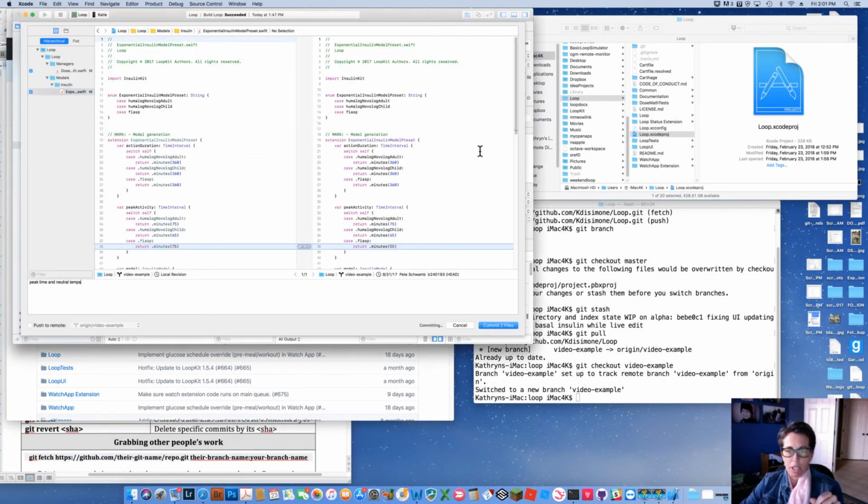That's called a push. So a commit goes to your local, usually if you're working on your local, and a push will push it up to your GitHub repository, your remote one, online. So I'm going to do both at once. I'm going to write them as a commit to my local, and then I'm also telling it to take those local changes and push it back up to my online account.